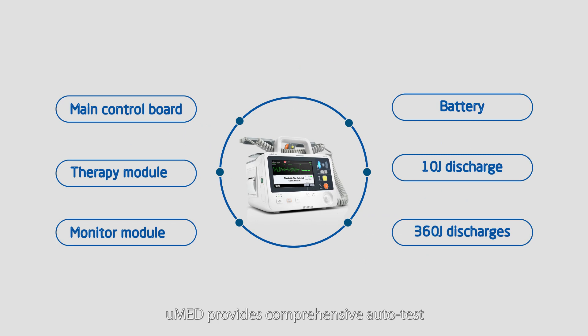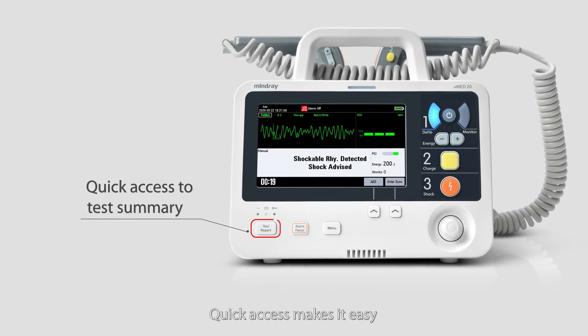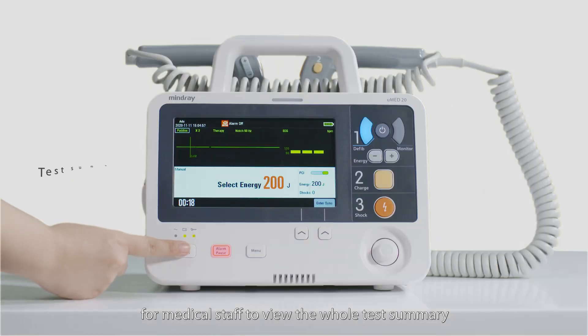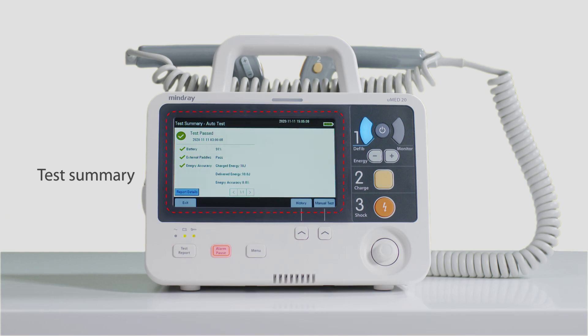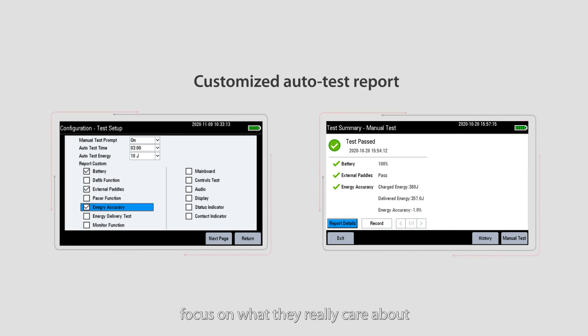UMED20 provides comprehensive auto test — no need for daily manual checks. Quick access makes it easy for medical staff to view the whole test summary. Customized auto test reports help users focus only on what they really care about.